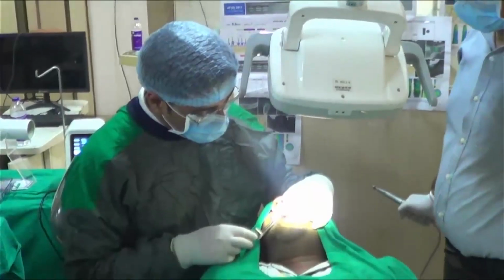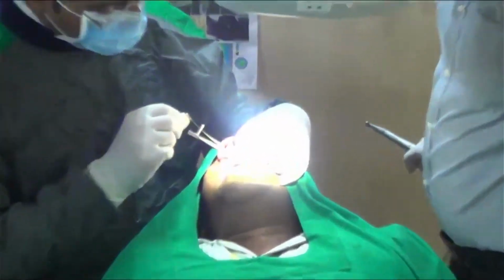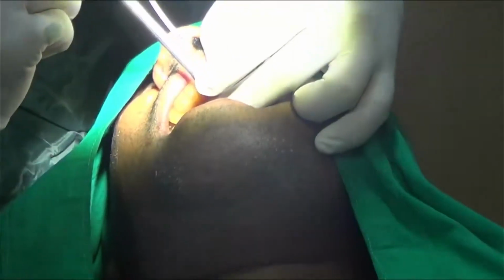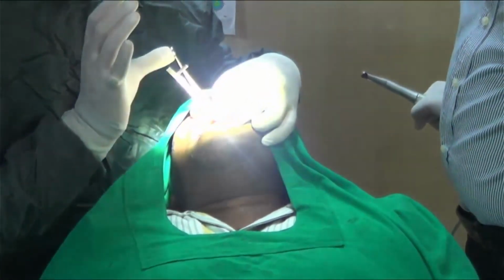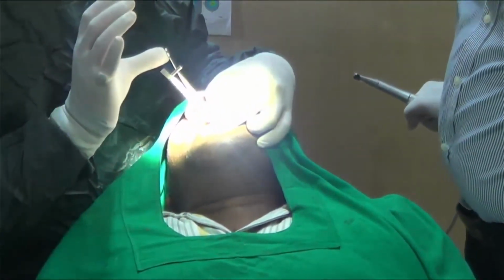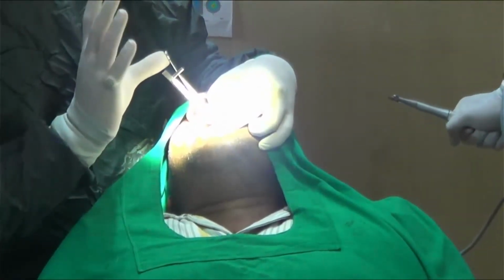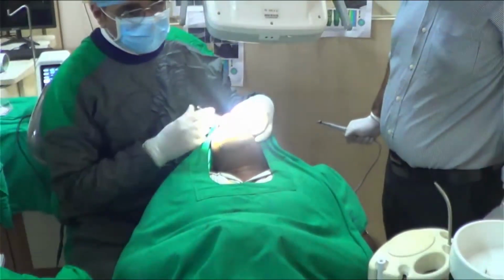Now it is fine. It is approximately 35 now. And I have reached my vertical depth. Okay. So this is how you can control the torque. And this you have to do, as I mentioned, since it is a harder bone in the upper part.